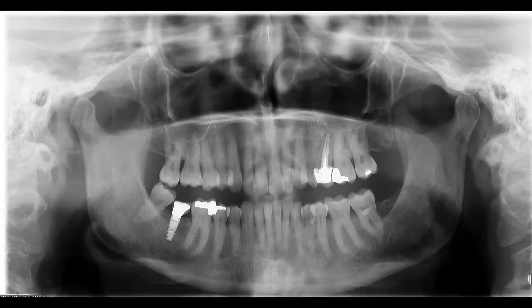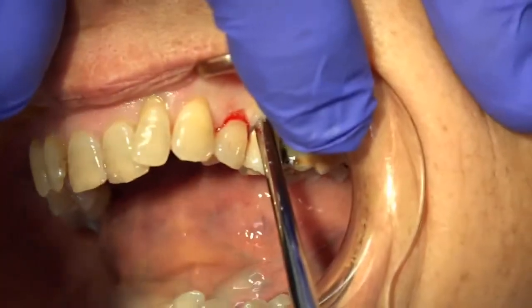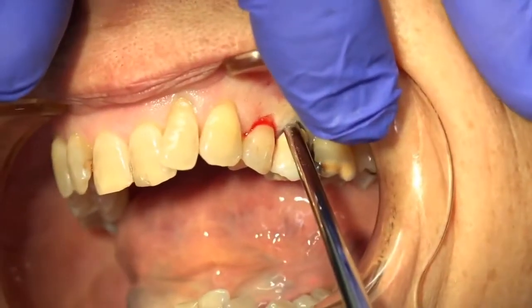In this video, we will demonstrate the protocol for 3D Bond when it's used for socket grafting, also when we have a buccal plate deficiency. 3D Bond is actually a short-term space maintainer. Therefore, this type of cement can be used only for socket grafting from first central until second premolar, with or without buccal plate, or molar with existing septum. So in this case, for example, we are going to extract the second premolar.